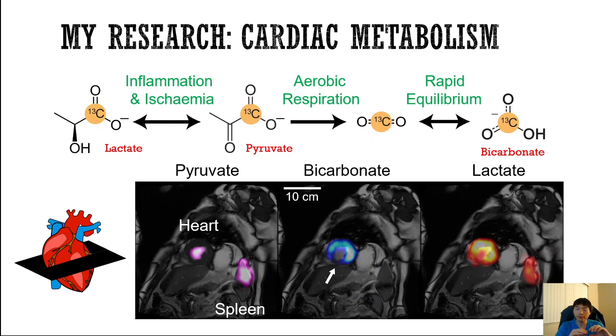So what that indicates is that perhaps the heart is still receiving some perfusion. Some of the pyruvate is getting to the muscle at the bottom, but perhaps that part is not receiving very much oxygen, and so maybe it's undergoing more of a conversion to lactic acid than to bicarbonate.